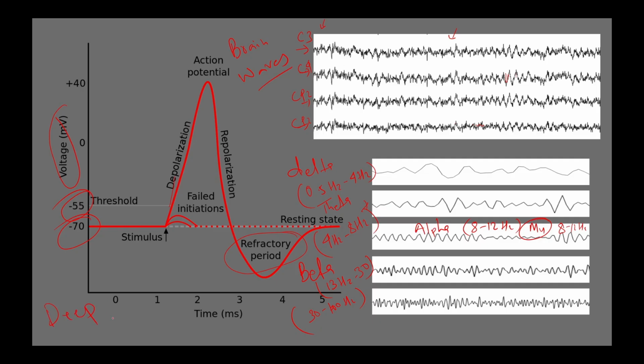Deep sleep is mostly dominated by slow delta waves, so we observe the delta waves of someone sleeping to analyze the state of deep sleep. Whereas when we want to know about the relaxed wakefulness state, we often see alpha rhythm.